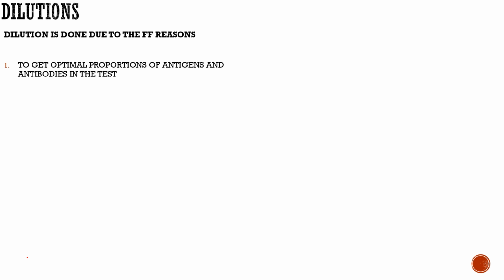Let's talk about your dilutions, class. Dilution is done due to the following reason. Tayo as medical technologists, we do dilution to lessen the concentration. Sa immunosero, its importance is related to this: to get the optimal proportion of antigens and antibodies in the test.